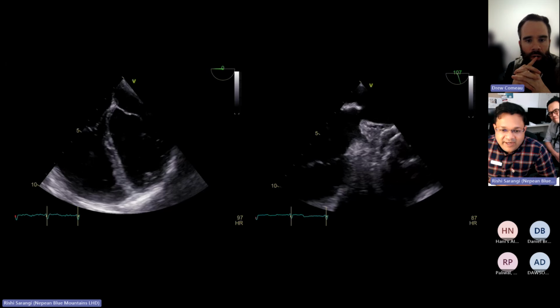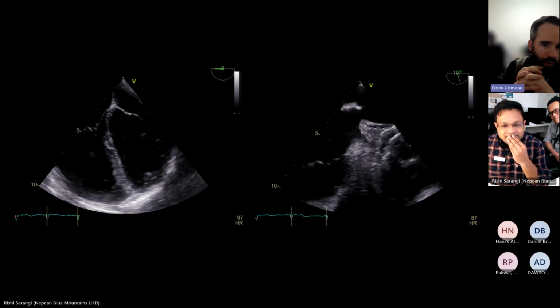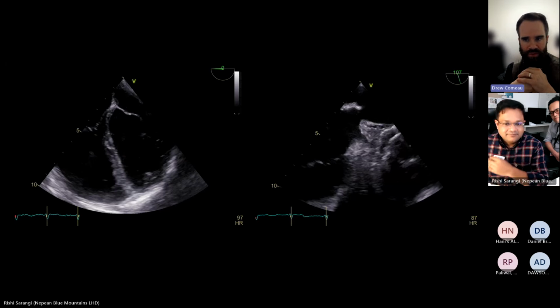It is the right atrium, intra-atrial septum. This is SVC coming here. Okay. Yep. All right. So I think what we're looking at is, although the orientation isn't ideal, the right ventricle does appear at least equally as large, maybe slightly larger than left ventricle. So indicates that there's right ventricular enlargement.